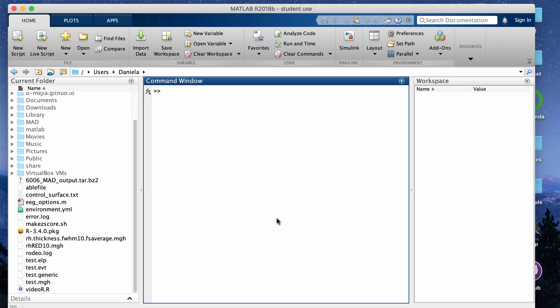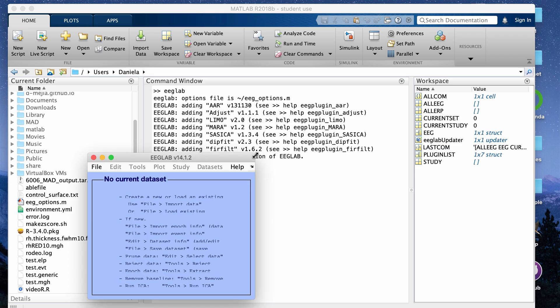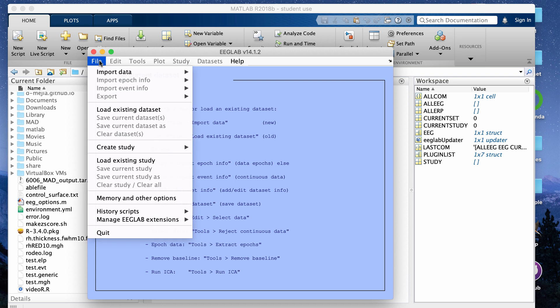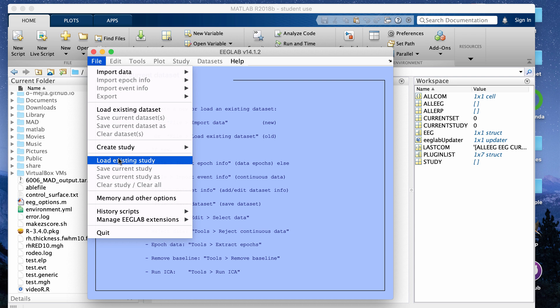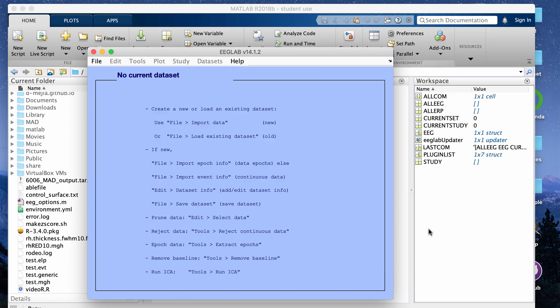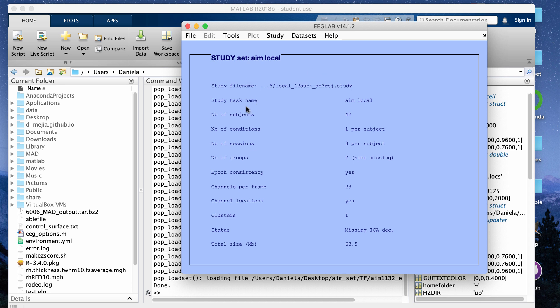In this video I'm going to go over how to create time frequency plots using a study in EEGLAB. I have MATLAB open and I'm loading in my version of EEGLAB. I'm assuming you've already created a study with information for all your participants. I'm going to load an existing study and load in the study data type. I have 42 subjects being loaded in, and when that's done the main window correctly shows 42 subjects.